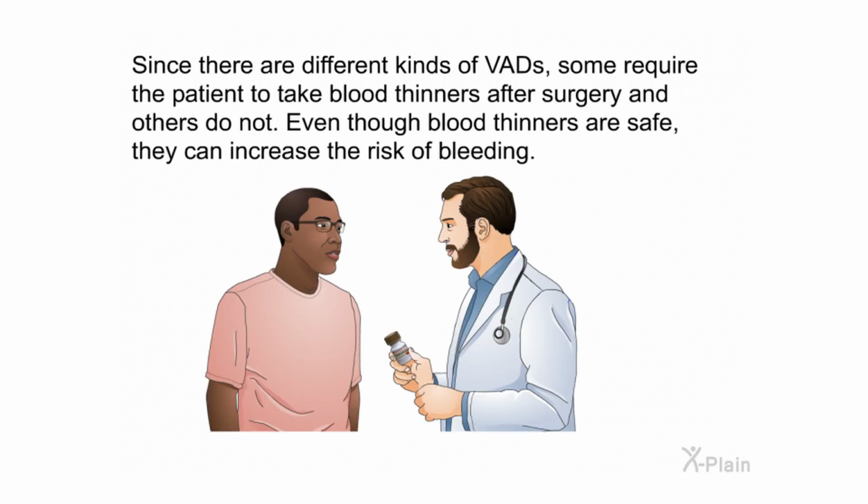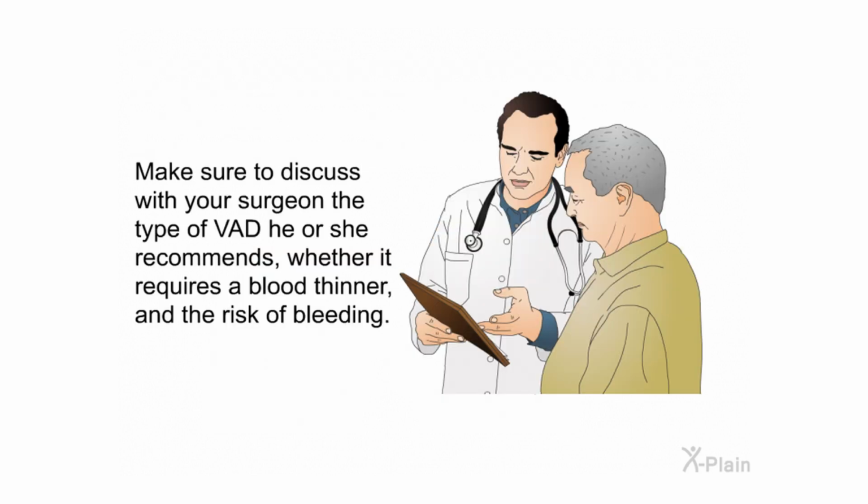Since there are different kinds of VADs, some require the patient to take blood thinners after surgery and others do not. Even though blood thinners are safe, they can increase the risk of bleeding. Make sure to discuss with your surgeon the type of VAD he or she recommends, whether it requires a blood thinner, and the risk of bleeding.